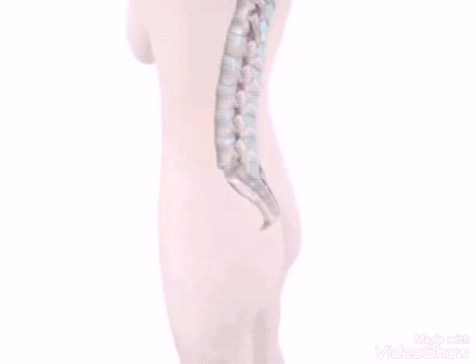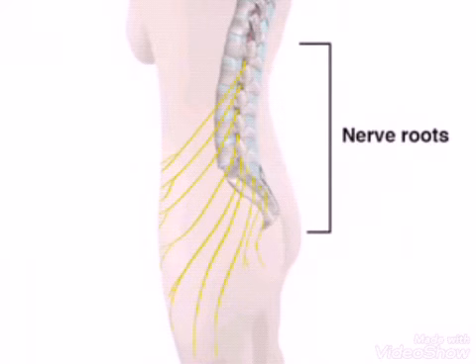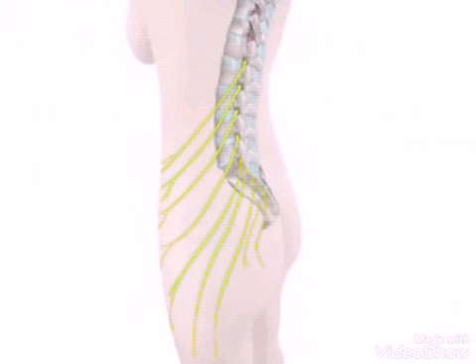Placement of a catheter in the lumbar epidural space allows one to administer analgesic and local anesthetic agents to a series of dorsal and ventral nerve roots that exit the spinal cord and traverse the epidural space, thereby providing anesthesia or analgesia to specific nerve root distributions.